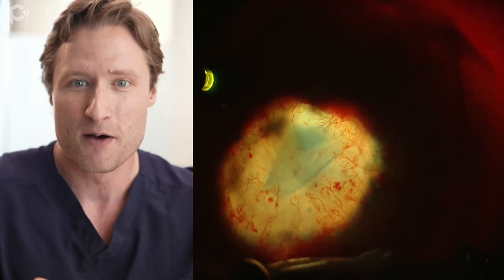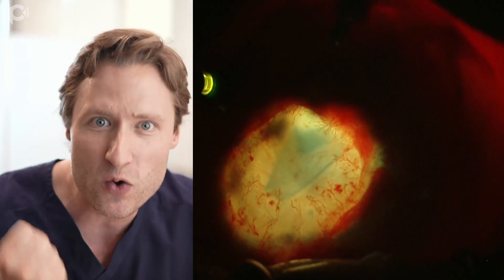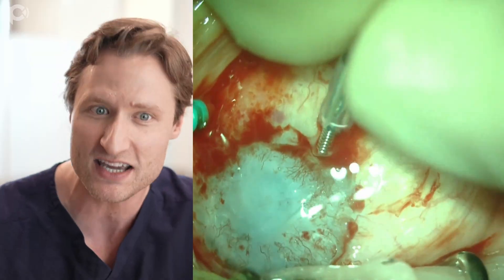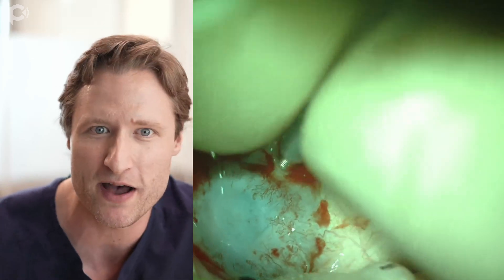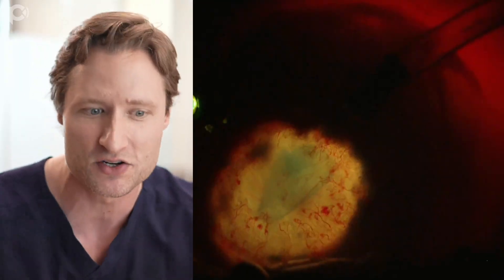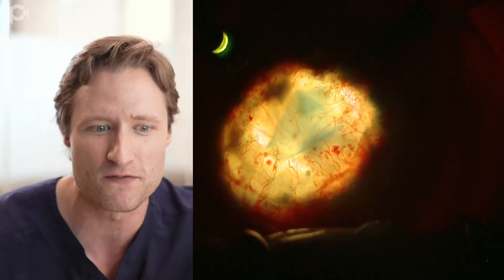The graft is right side up. The part of the graft away from me is cramped - smashed between the back of the cornea and the front of the iris. But I know the graft is right side up, and if we can unfold this, we win. So I'm putting the anterior chamber maintainer back into the eye at a low rate of fluid inflow - about 15 cc's per minute, just a little more than a dribble - because I don't want to uncontrollably expand the anterior chamber.